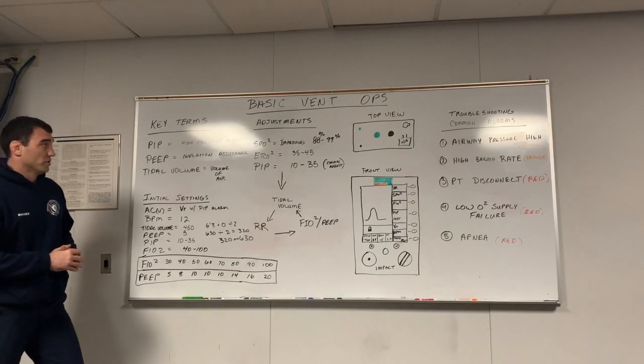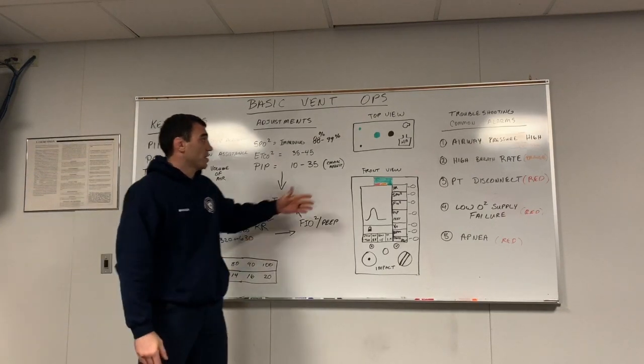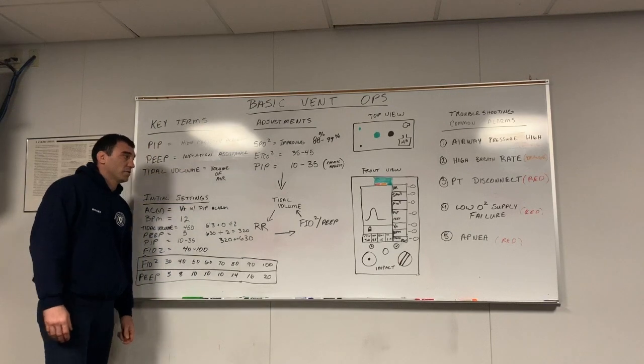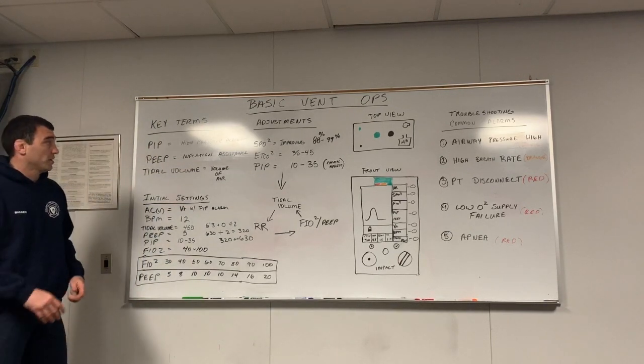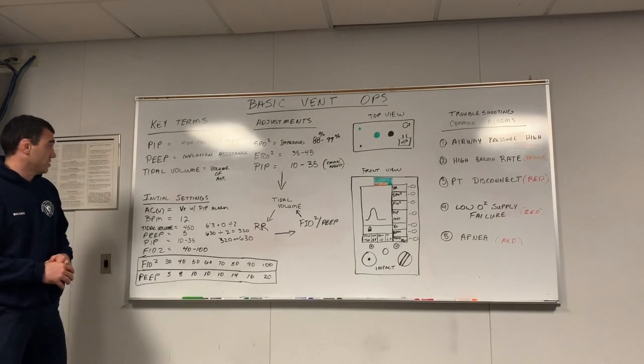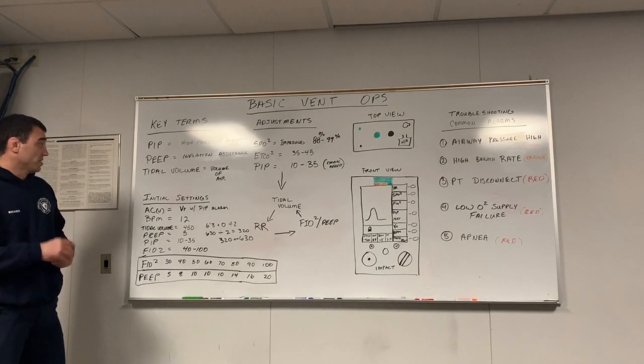So for the vent in general, I drew a picture over here. We're going to talk about it. I'll use this to show this. If you have your ventilator when you're watching the training, you can have it in your hand and you can be looking directly at your vent. We drew a picture so it's easy to see there too. The initial settings on the vent.